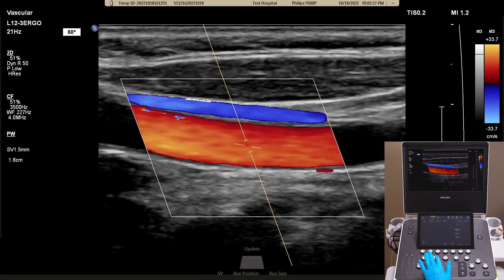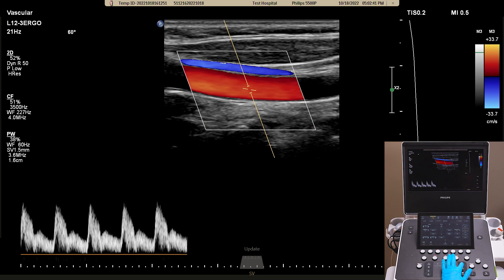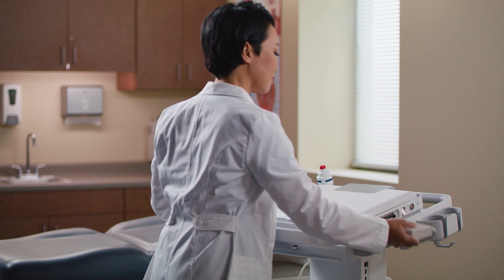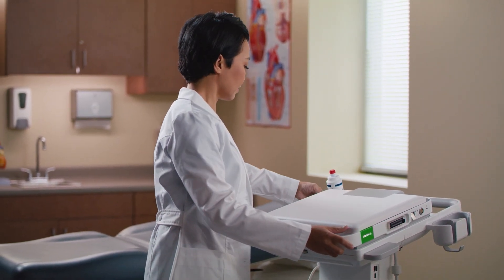You may also use our MaxView option to increase the image size and see more in high detail. The Philips Ultrasound Compact 5000 Series is built to optimize both portability and performance.